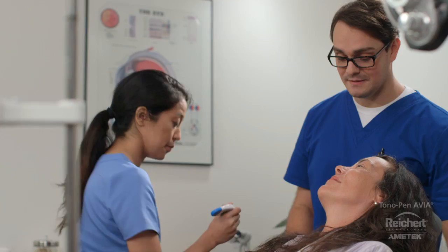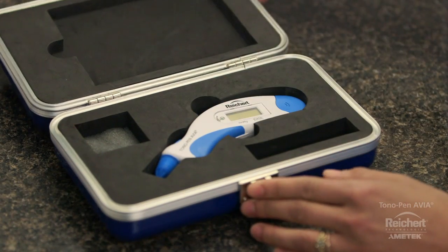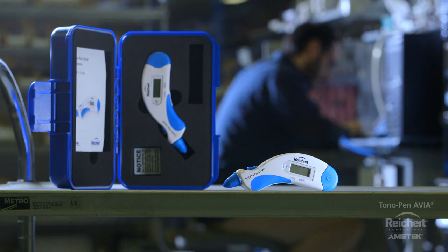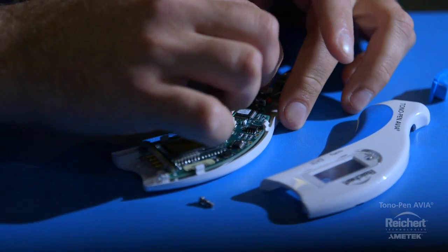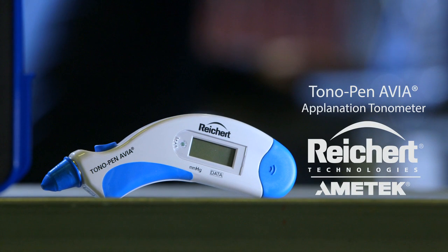Built on a 30-year legacy of trusted reliability and backed by hundreds of publications, clinicians can be confident in Tonopan Avia. Proudly made at our state-of-the-art world headquarters in Buffalo, New York, USA. Tonopan Avia by Riker Technologies.